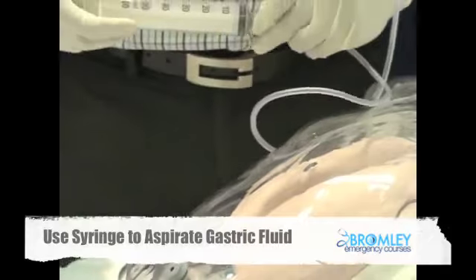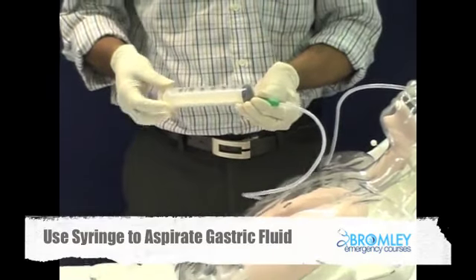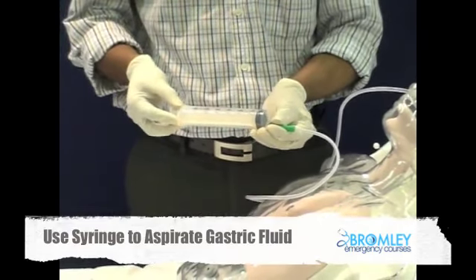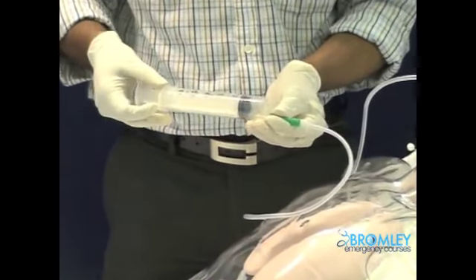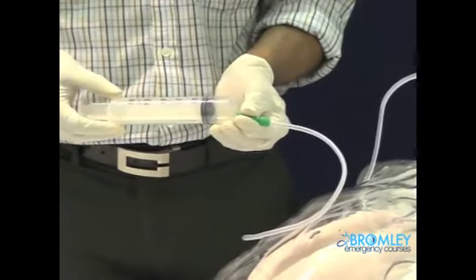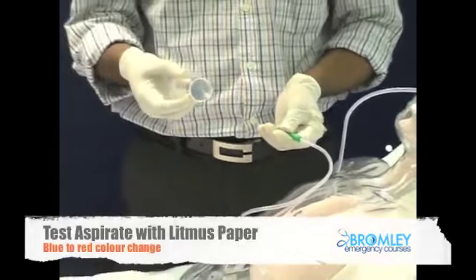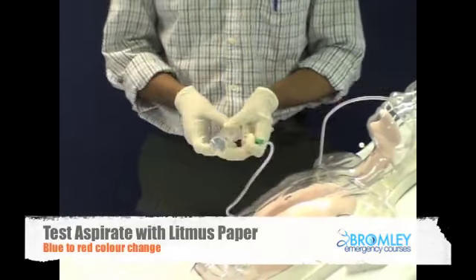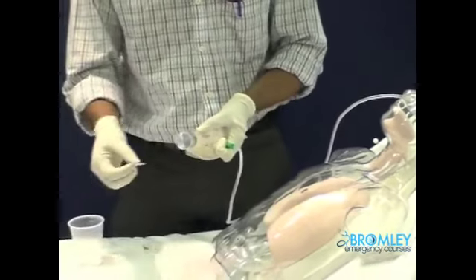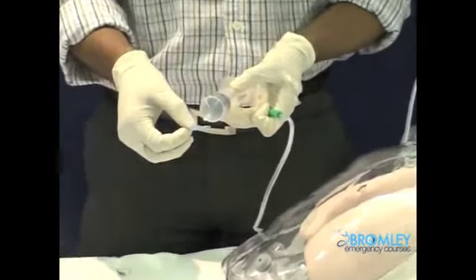take a 20 ml or 50 ml syringe, attach to the top end of the NG tube and aspirate, and we should get a good aspirate as one test of making sure the NG tube is in the stomach. Once you take an aspirate, you can test this liquid because it should be acidic, pH should be less than 6.0. The litmus paper should turn red, and there are markings on the litmus paper.